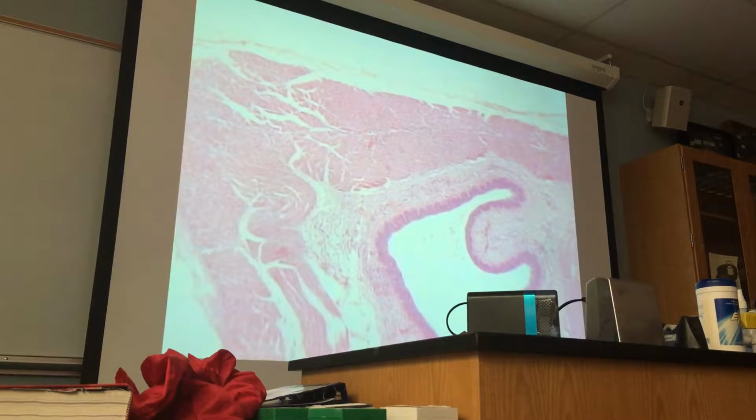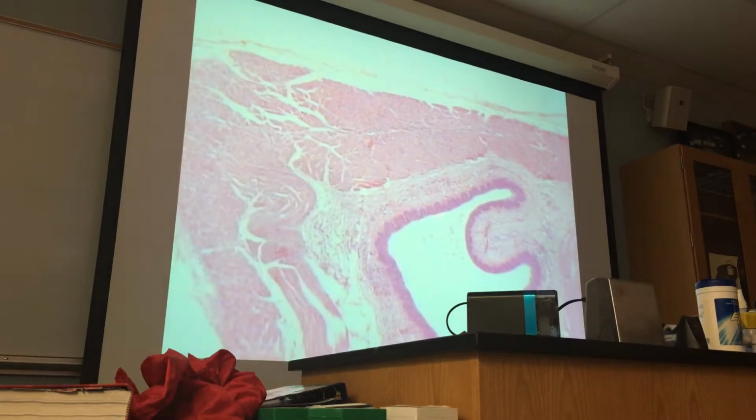Okay? What is this? Lumen of esophagus, mucosal epithelium, or simply epithelium.